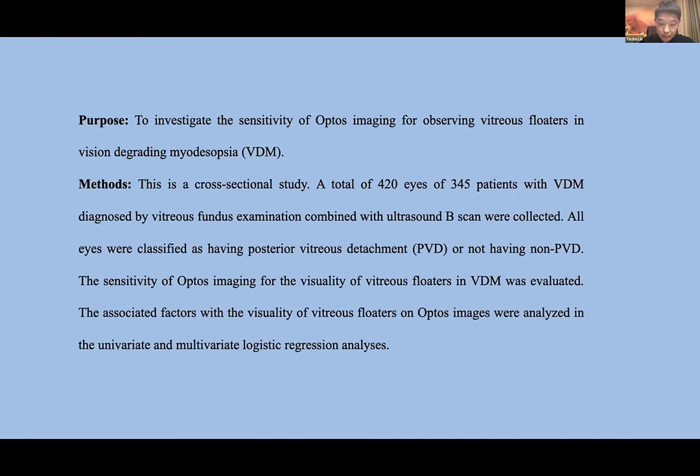All the patients presented with vision-degrading myodesopsia. All patients had symptoms, and we assessed them using vitreous and fundus examination combined with ultrasound scan. All the eyes were classified as having posterior vitreous detachment or not having PVD.